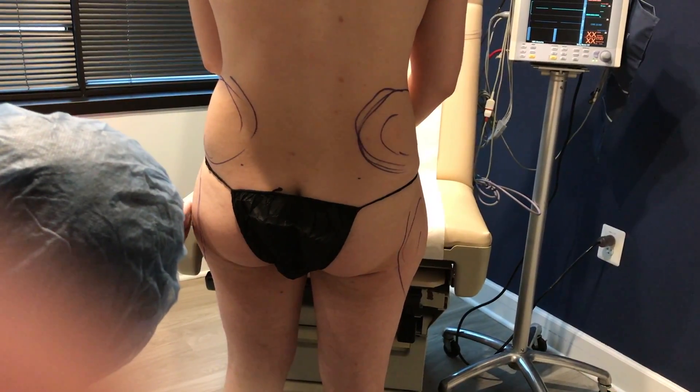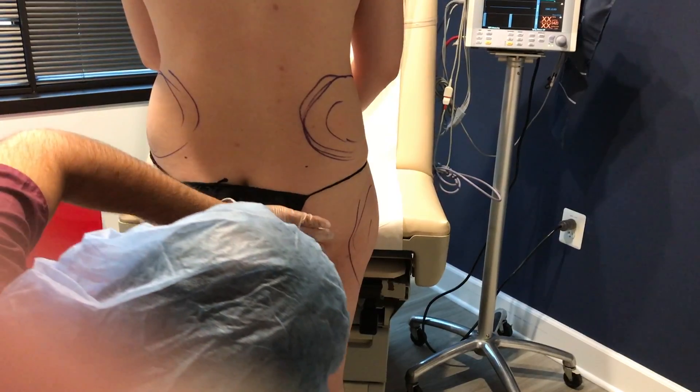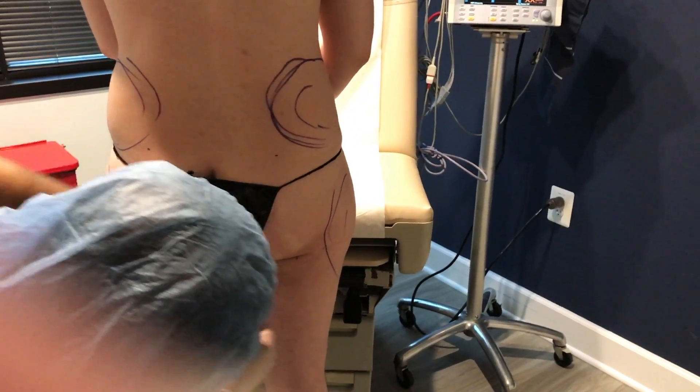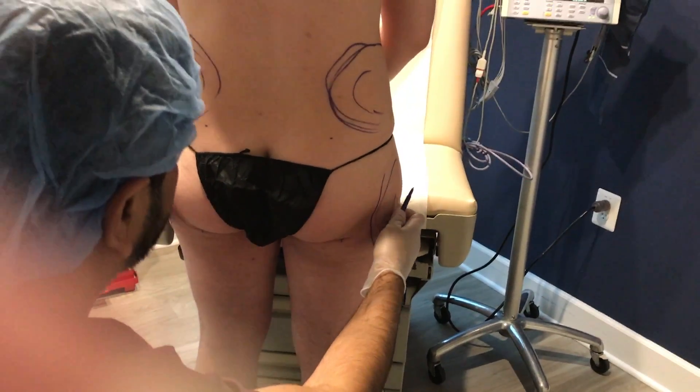So we're in our FTM surgery. We're going to bring this in and do that from a tiny incision hidden inside the buttock crease. It'll just be a little needle hole and we won't be able to see it.